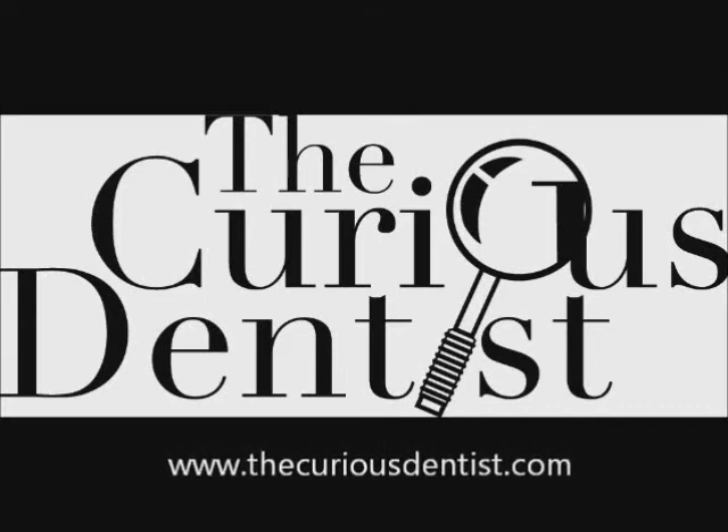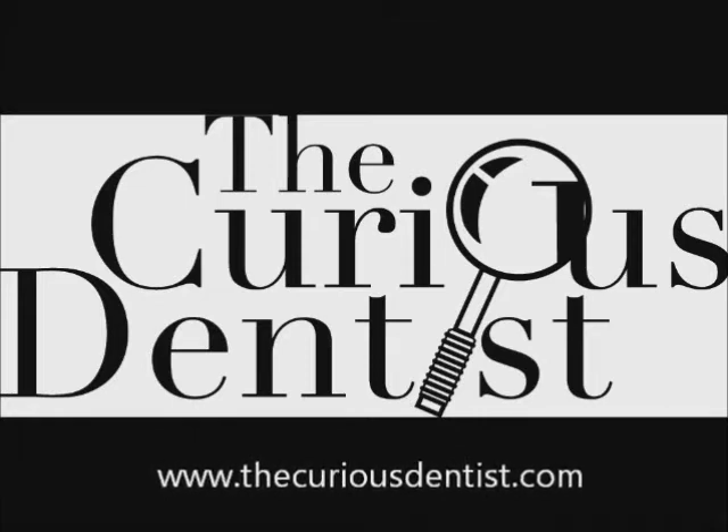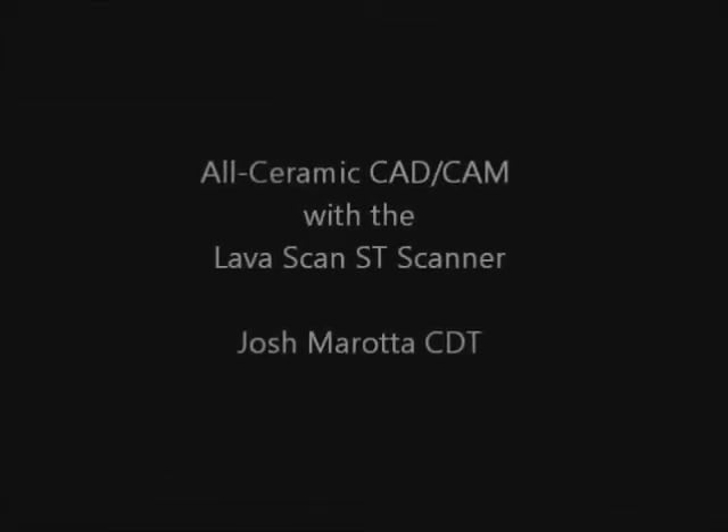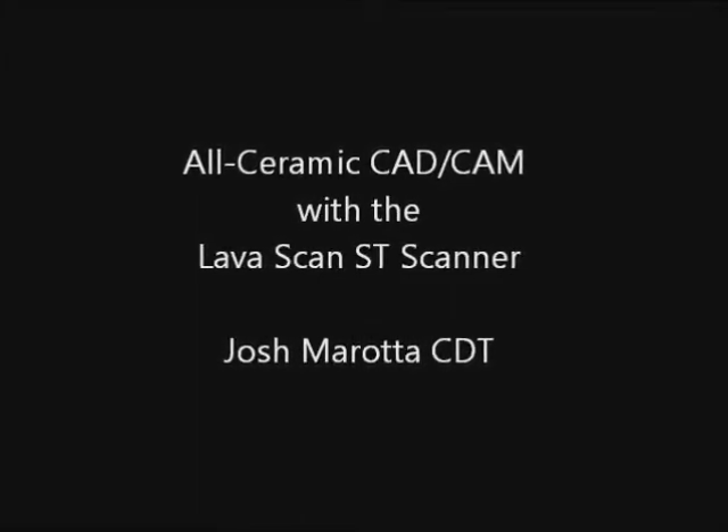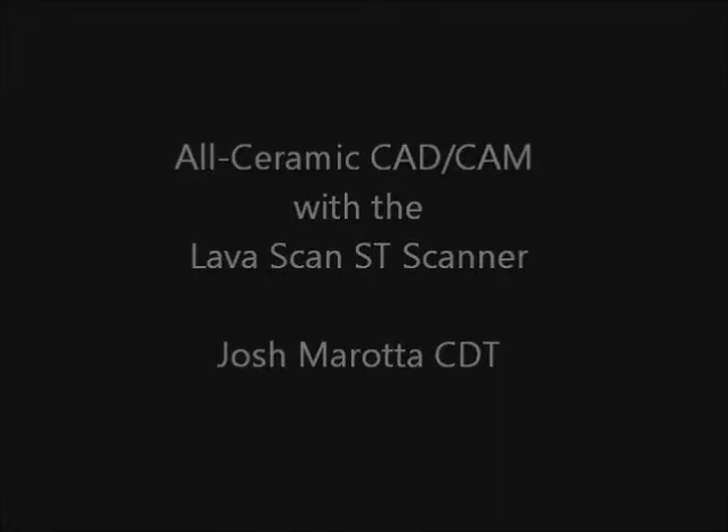Hello my friends, this is Chris Slaner with The Curious Dentist. I wanted to get a behind-the-scenes peek at how a laboratory fabricates all-ceramic CAD-CAM structures. My friend Josh Murata at Murata Dental Studio took us behind the scenes with their Lava Scan ST Scanner.